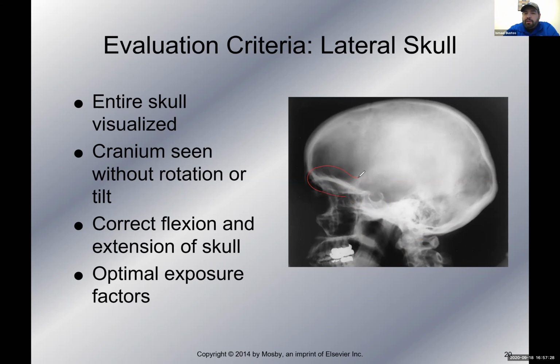So that's the first structure you can look at, and that's the first thing you should look at for tilt, right? Of course, the other structures would be the greater wings of the sphenoid, sella turcica, and the EAMs, right? Because if we saw an EAM there and we saw another EAM up there, then we have tilt, okay? So remember, the three structures that can be used for both are the greater wings, sella turcica, and the EAM. Those three structures can be used to determine both tilt and rotation. The plates or the orbital roofs are used for tilt. The mandibular rami are used for rotation.